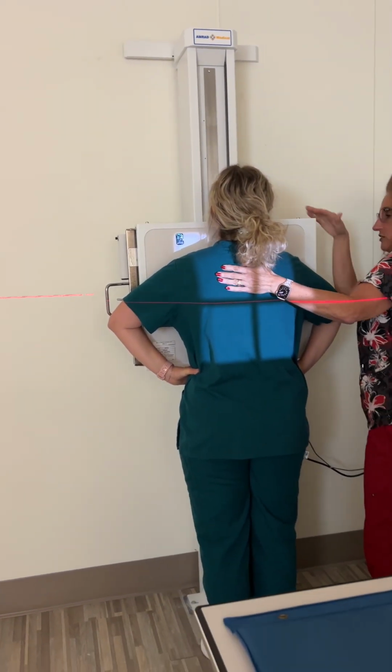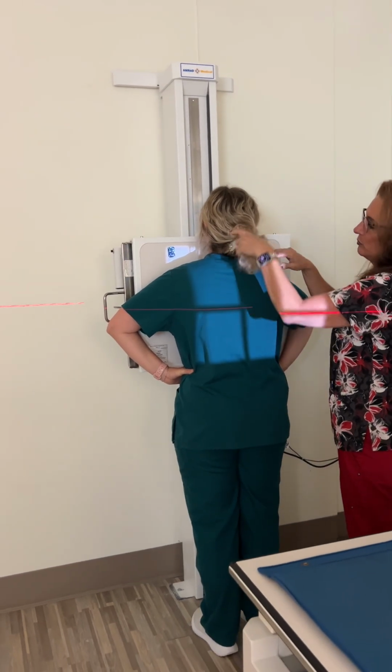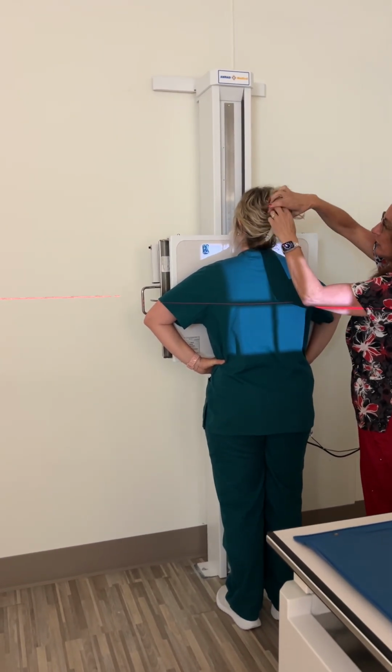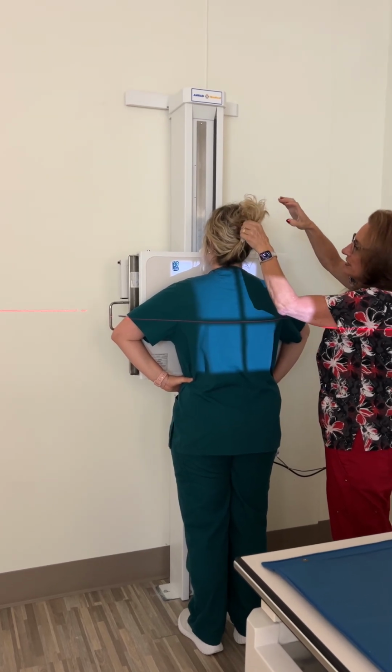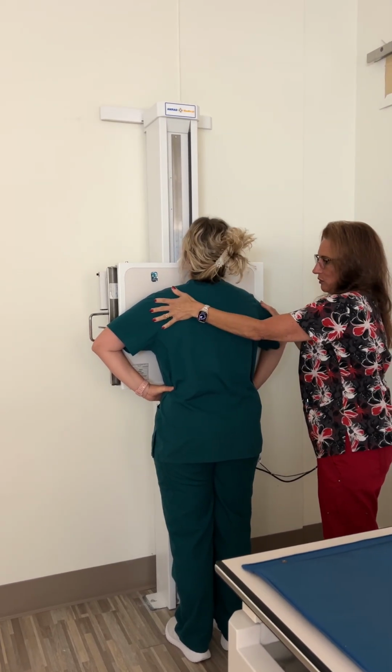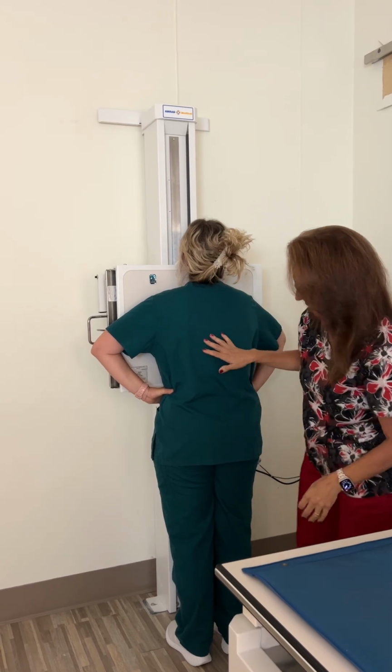Your chin does not have to go up on that. I would probably be mindful of her hair clip. Can I move it out? Mm-hmm. Just so that I'm not getting that in the way. Good. All right, just like that.